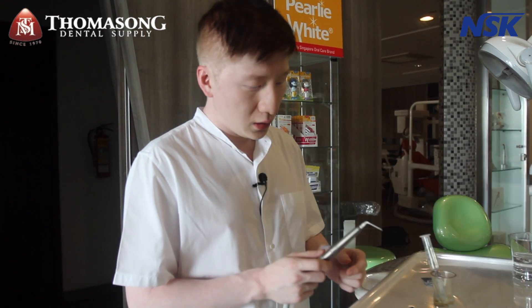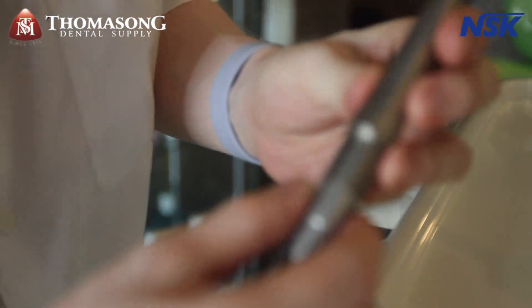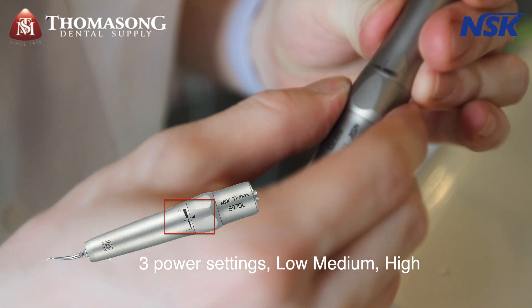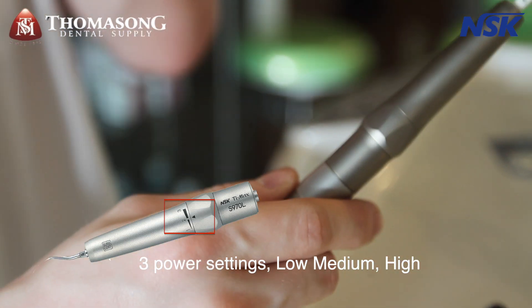There are three levels in the Airscaler itself — low, medium, and high. Right now I'm at low, but there's also medium and high settings available.